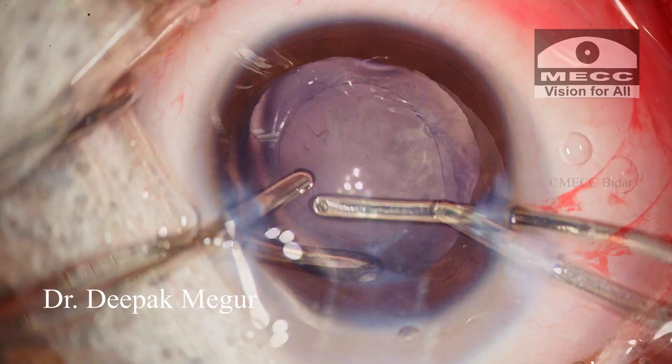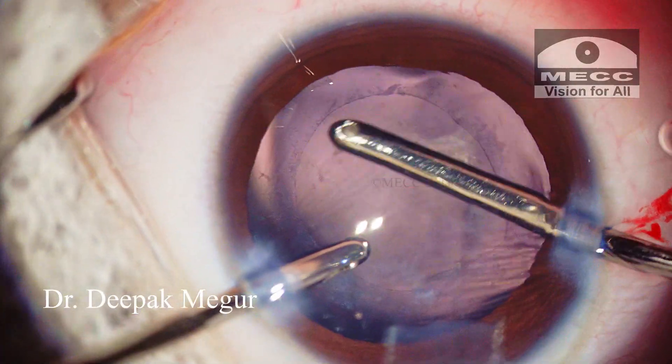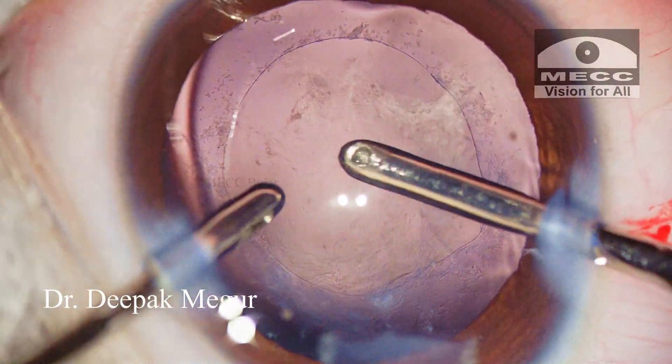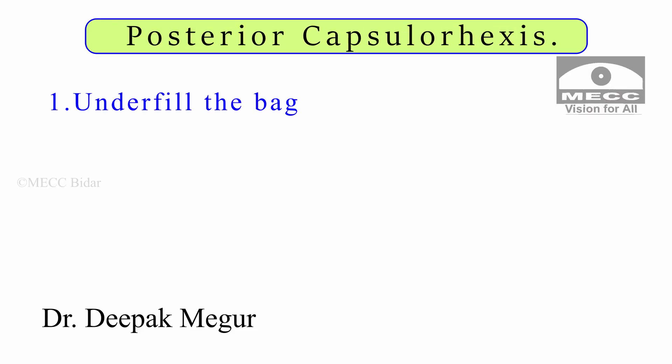Now moving on to the most critical aspect of the surgery — performing the posterior capsule rhexis. While performing the posterior capsule rhexis, I follow these principles: underfill the bag with OVD so that the posterior capsule can be reached easily and then perforated without much stress. On the contrary, if we deepen the bag significantly, then visualization of the posterior capsule becomes difficult.